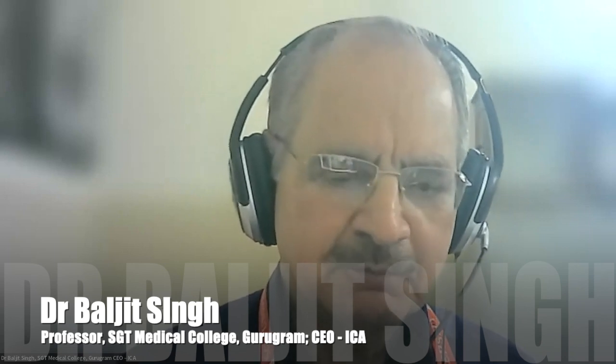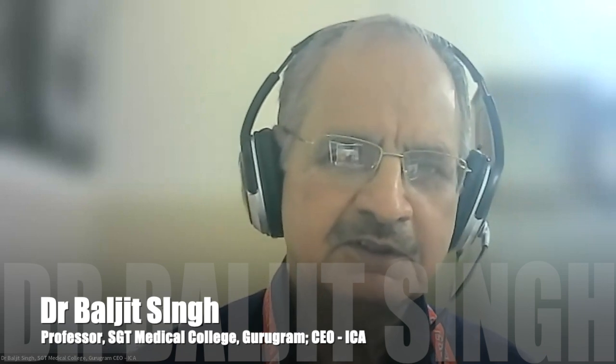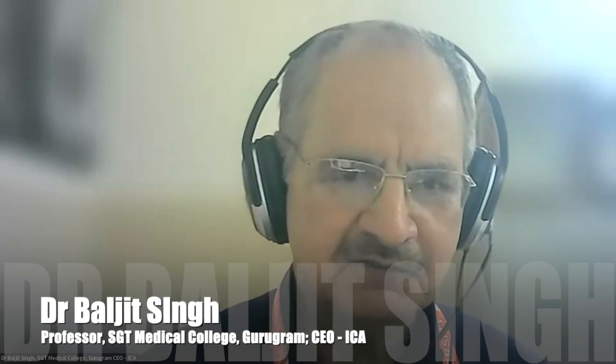Sir, a very important issue. We have come a long way from the times when there was no anesthesia machine, just some bellows and a small contraption in the name of an anesthesia machine. When the machines first came, we didn't have any power backup. If the power went, we would depend on a torch and keep on watching the rotameters to see how much gas was going.